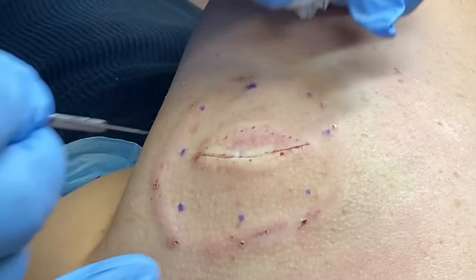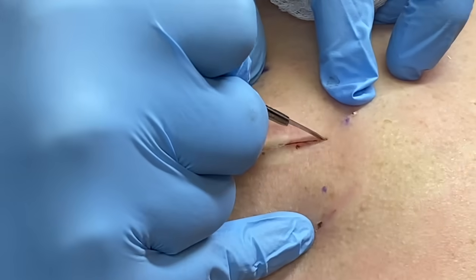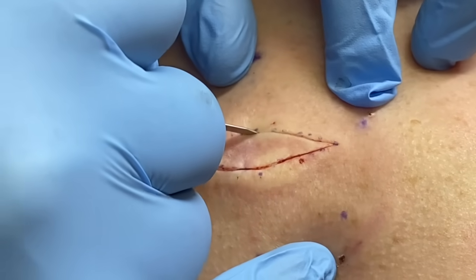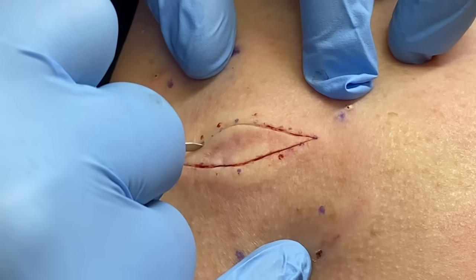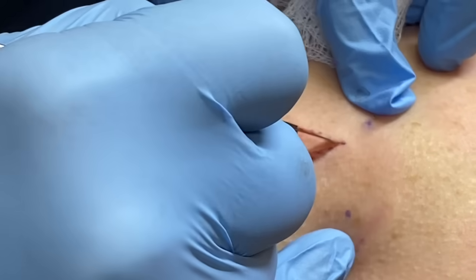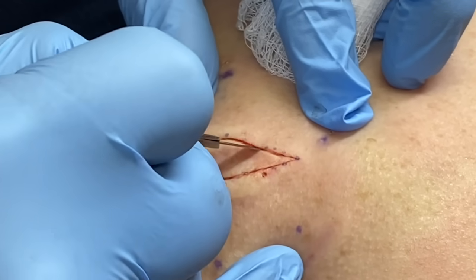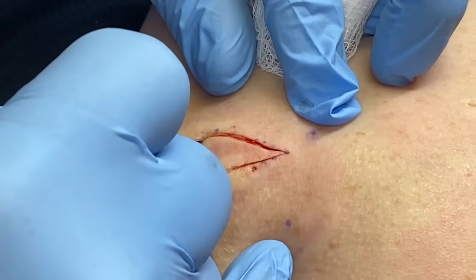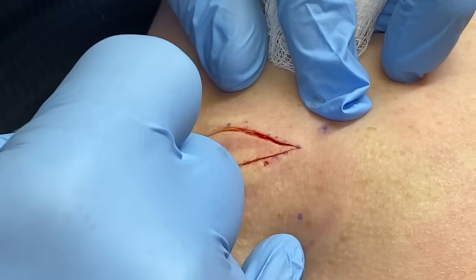And why an elliptical incision versus a linear incision? What are the pros and cons? Well, in a tented lesion like this, you can approximate the tissues easier because you're going to be removing some. It's so hard to draw it back together with just a linear. There's an argument to be made without dog-earing. You're going to have redundant tissue, right? Because this is swollen because she's developed it like that.